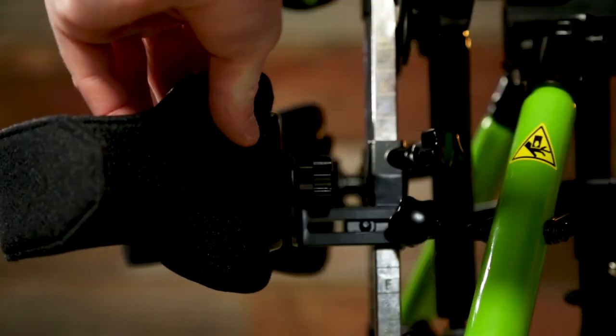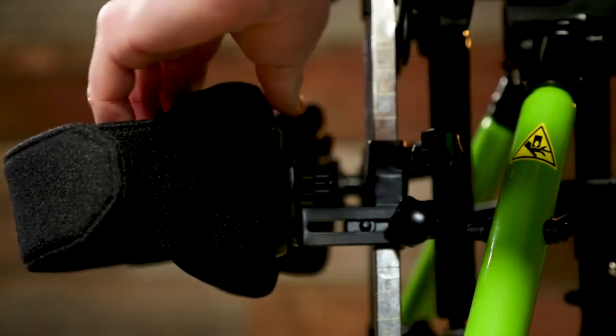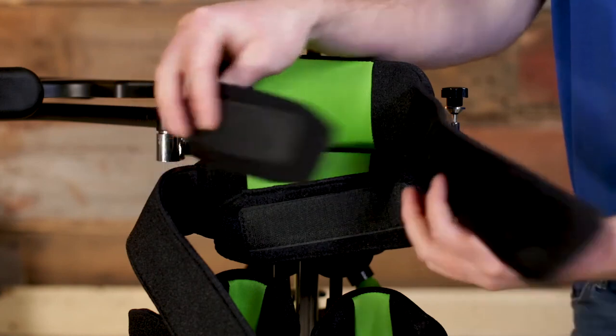This all means less time transferring and more time reaping the benefits of standing with anatomically correct hip abduction.